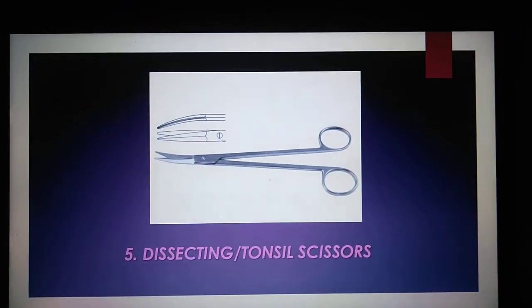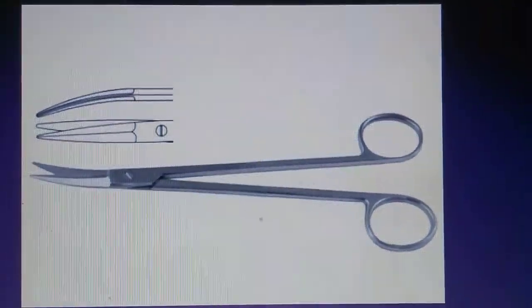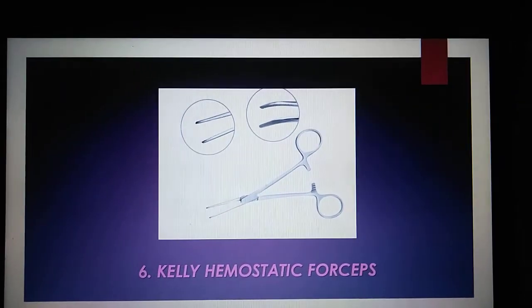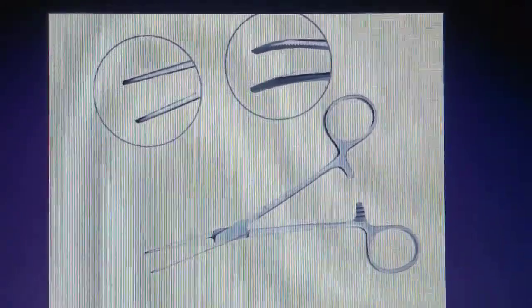Dissecting or tonsil scissors are used for cutting and sectioning of tissues. The Kelly Hemostatic Forceps are used for clamping large blood vessels or manipulating heavy tissue.